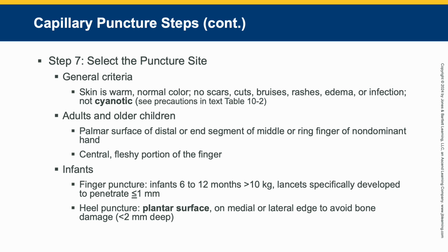Avoid scarred sites and healed burns, because there may be problems puncturing it correctly and you may not get a good specimen. Avoid swollen sites or sites with edema. That's because excess tissue fluid from these sites can contaminate the specimen, and again, you would have erroneous results.